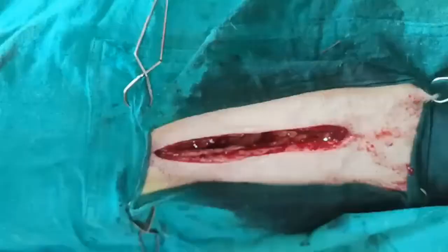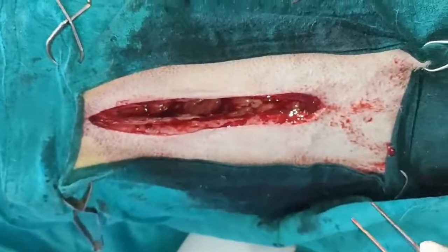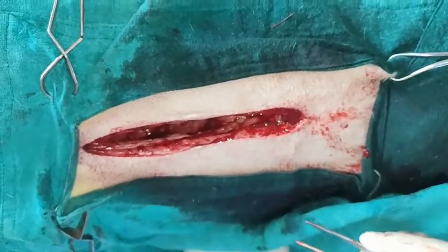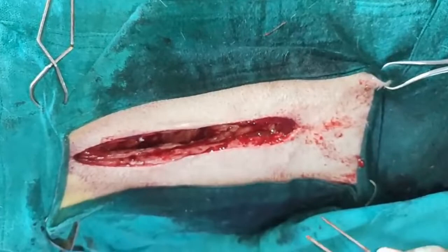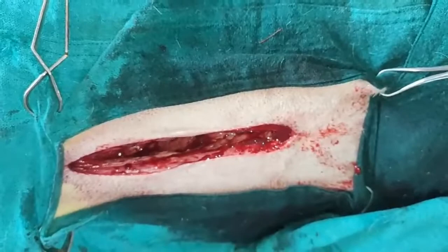So we have successfully removed the mango kernel. We tried to repair it by simple continuous suture, that is the enterotomy, but we failed. Then even the enteroplasty, that is the suturing of the longitudinal incision into the horizontal one, also failed. We found during surgery that the tissue is not viable and is fragile. So we decided to cut the affected area, and we performed the intestinal anastomosis in two layers, followed by omentalization, which is very important.